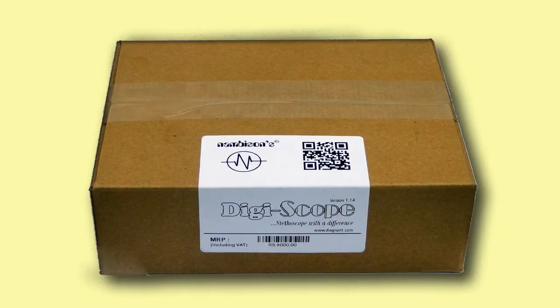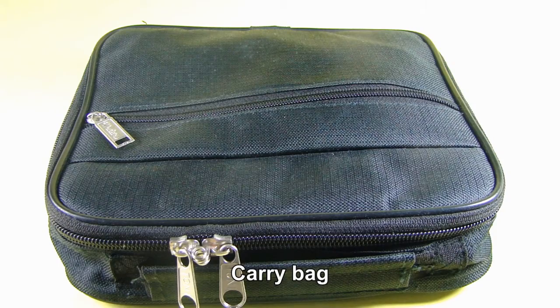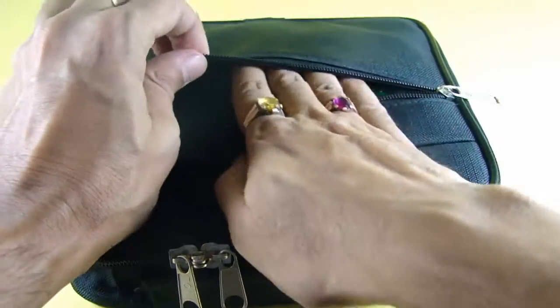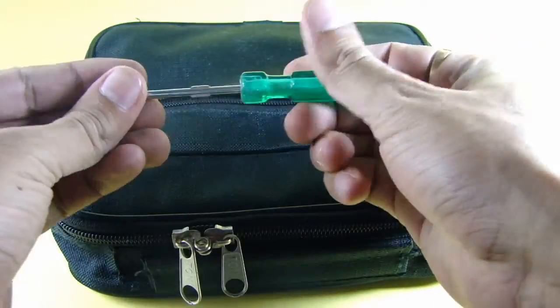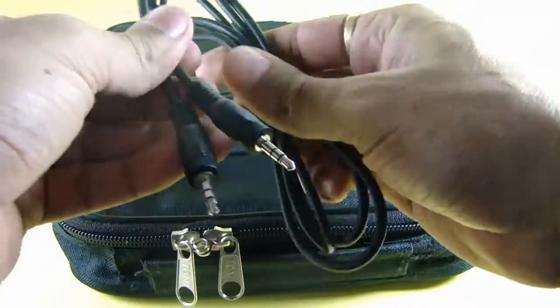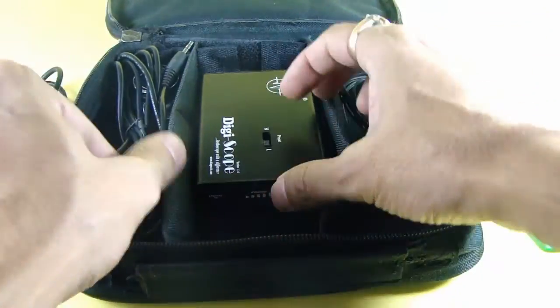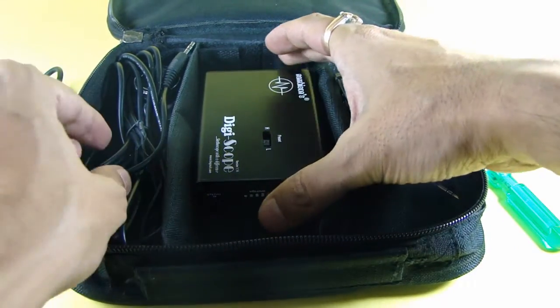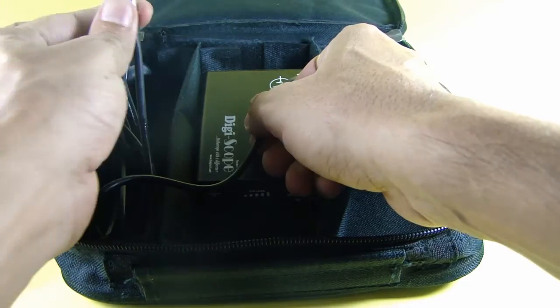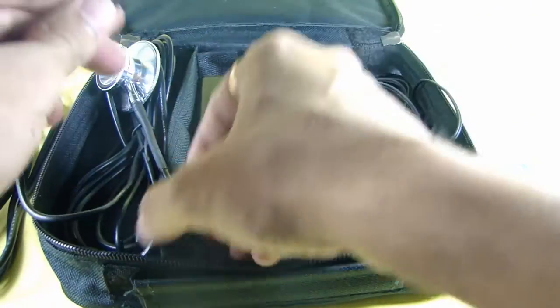DIGISCOPE HD comes in a box. When you open up the box you get a nice carry bag. This carry bag has an external zip where you find a screwdriver and double-sided audio cable. When you open the main zip, you find three chambers: the central chamber holds the main digiscope unit, the left chamber holds the stethoscope chest piece with three meter long wire, and the right chamber holds the earphone.